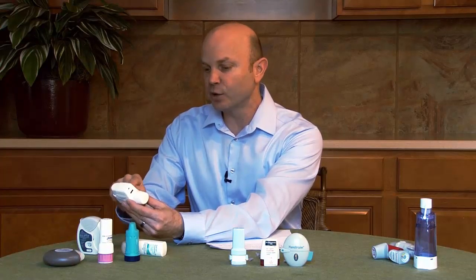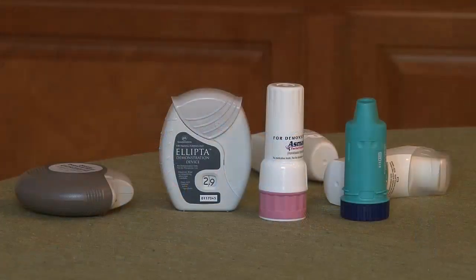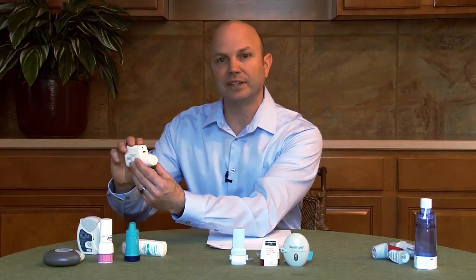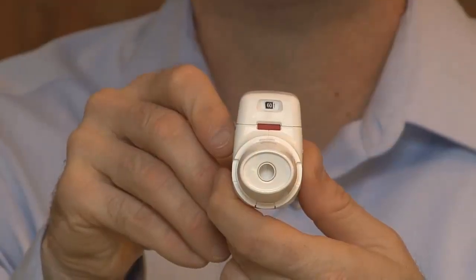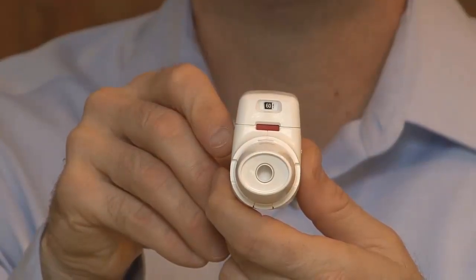The medicine is located inside of the device, so never take these apart to look and inspect to see if you're getting all the medicine. It's not designed to do that. The other thing to note about these devices is you never want to shake them like you would for the inhalers. If you shake these devices or you blow into them, you'll actually blow the medicine out of the device and you won't be able to inhale that into your lungs.